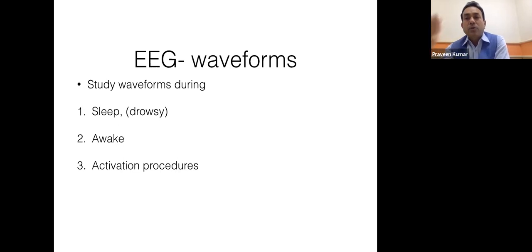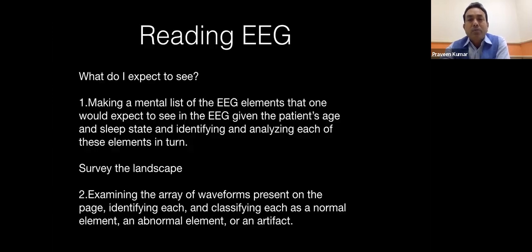And waveforms also change with the activation procedures. We'll talk about the hyperventilation and the photic stimulations. So when you see the EEG waveforms, you've got two ways to see these EEGs.